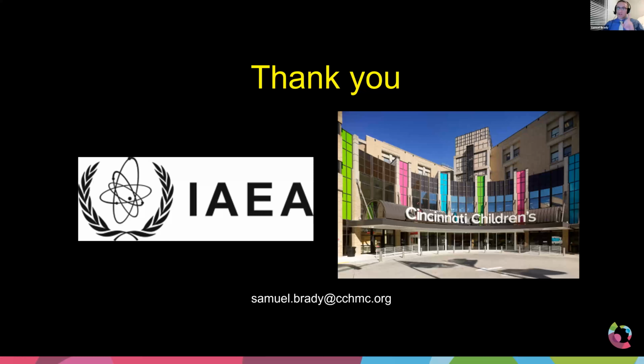So the one thing I did not talk about, because it's still mostly academic, is photon counting. And that's where, kind of like in nuclear medicine, we physically count how many photons come out of the body and collect in the gamma cameras and the PET scanners. We know exactly how many photons come out. Therefore, we can reconstruct the image specifically, knowing how many photons are here and how many photons are here. We don't do that in CT. We just dump. It's like taking a big bucket of water and you just dump it on your head. It's hard to count how much water got your hair wet. In CT, we can't count all those photons because we use so many photons.